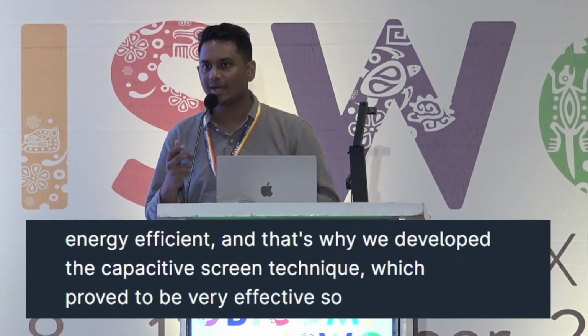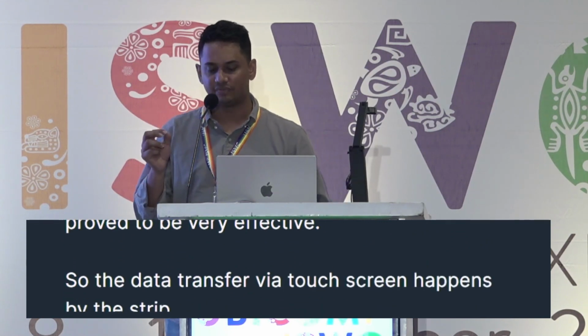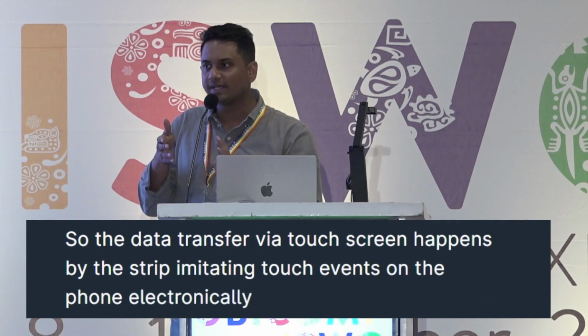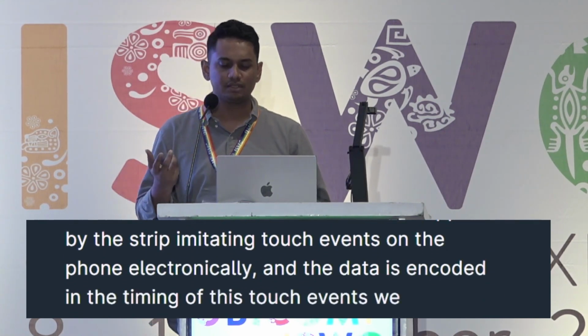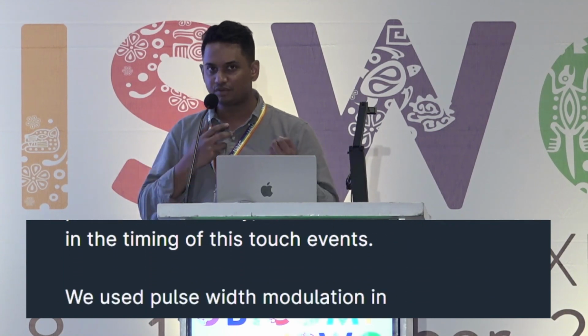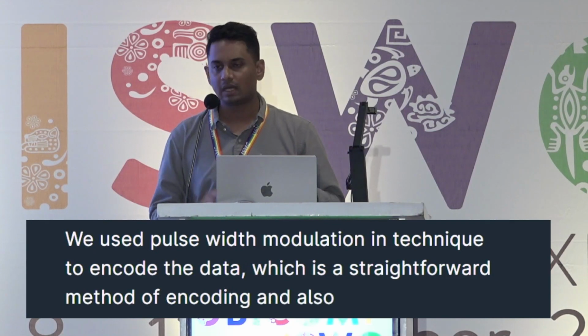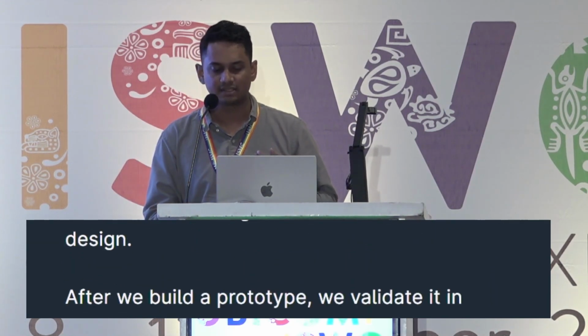The data transfer via touchscreen happens by the strip imitating touch events on the phone electronically, and the data is encoded in the timing of these touch events. We used pulse width modulation to encode the data, which is a straightforward method of encoding and also for hardware design. After we built a prototype, we validated it in in vitro and clinical studies.